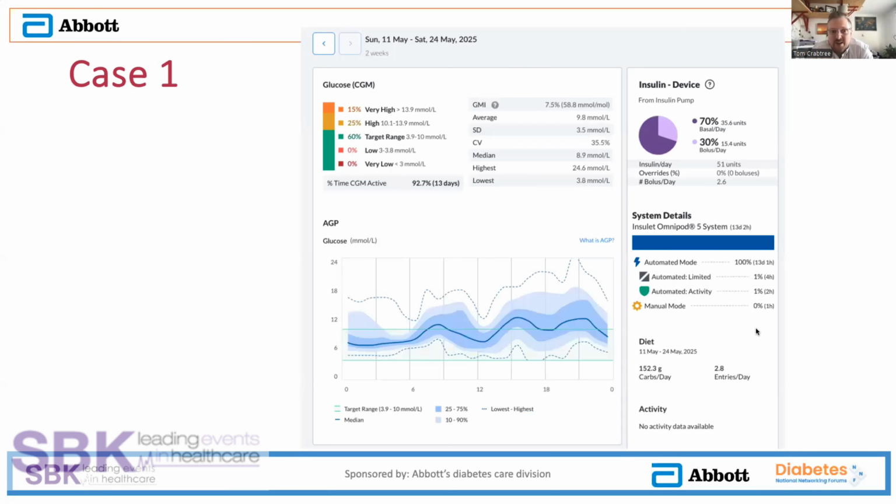Now, to me, this fits very much with someone working in a healthcare environment because you've got clear rises with each meal, which to me means that there's either an issue with carbohydrate ratio, but the other thing to think about is bolus timing. And we talk a lot about pre-bolusing. It's probably the thing that we talk about more than anything in clinic, but it's even more important on closed loop to do this where possible.